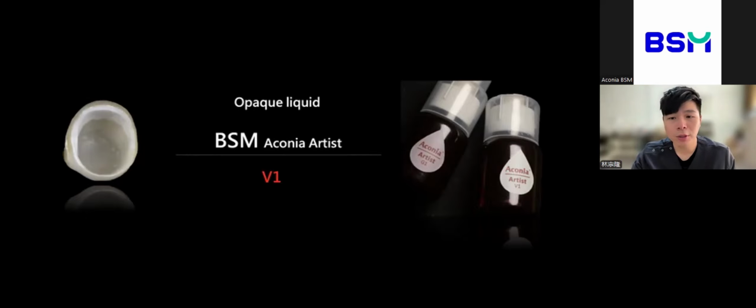This helps reduce the obvious white or bright look from the buccal side, while still keeping a nice masking effect. I sometimes combine opaque liquid and the liner to create a double masking effect and reduce the uncertainty as much as possible.